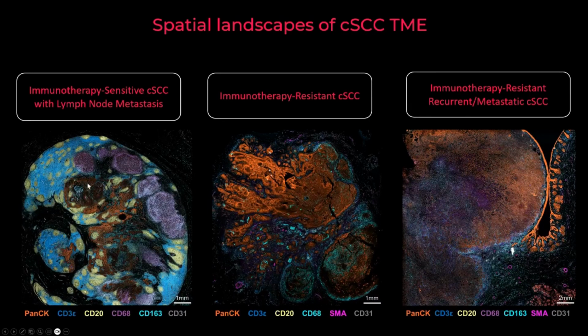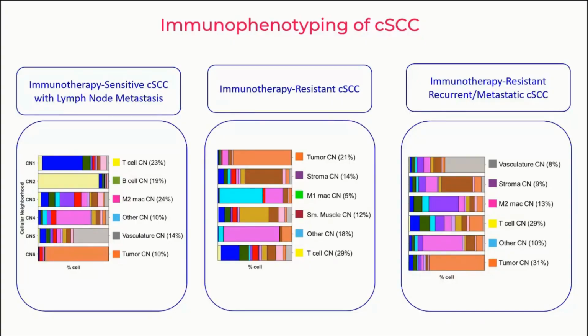And then what we see in this tumor on the left here is we have this highly infiltrated, macrophage-infiltrated tumor region on the periphery, but really highly active tumor regions in the middle. We can take this same immune cell profile of the tumor and now look at the composition of them. So this is now looking at the different neighborhoods and cell types within each of these individual tumors. And this is your base reading into this, and it's where most of the field is.